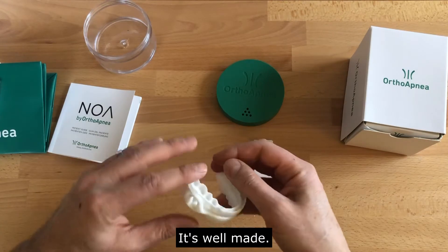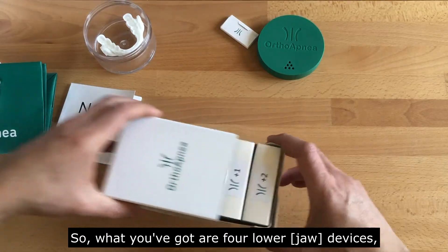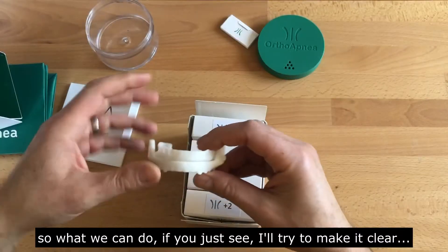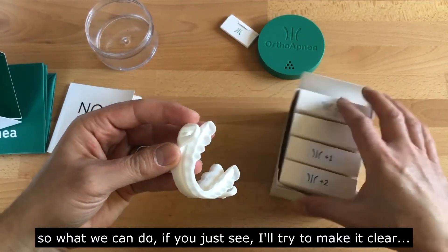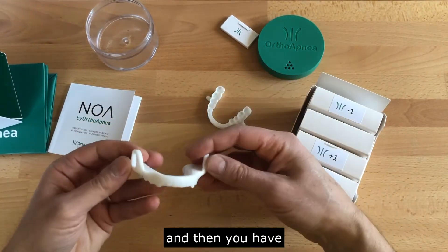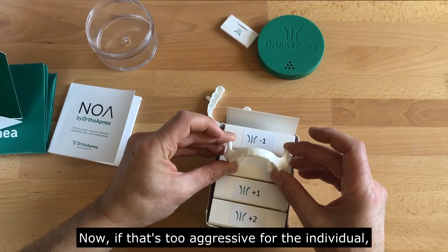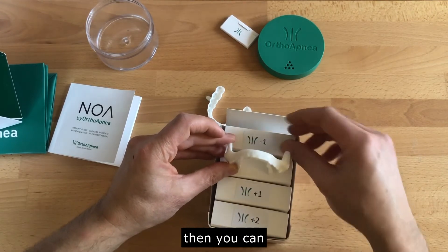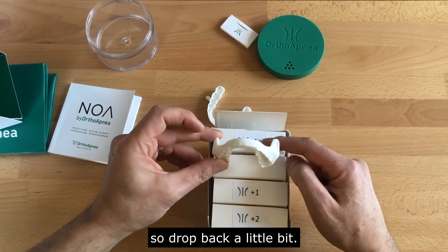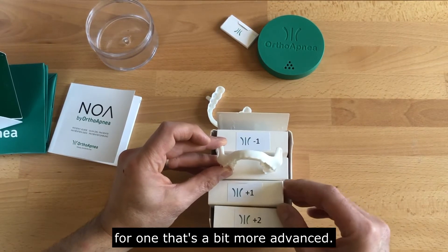It's beautifully smooth and well made. So how do you adjust it? How do you titrate the patient? What you've got are four lower devices. You can just flex it slightly, keeping the upper device, and then you have interchangeable lower ones. This should be the starting point. If that's too aggressive for the individual, you can reduce the protrusion slightly with another lower — drop back a little bit.